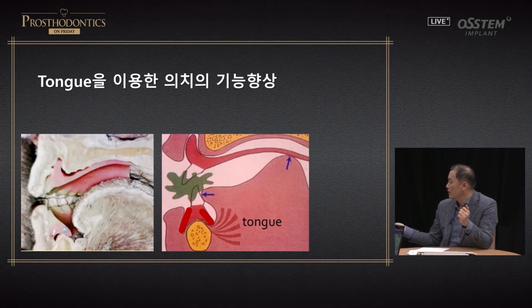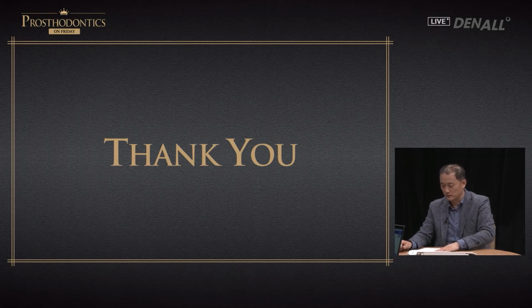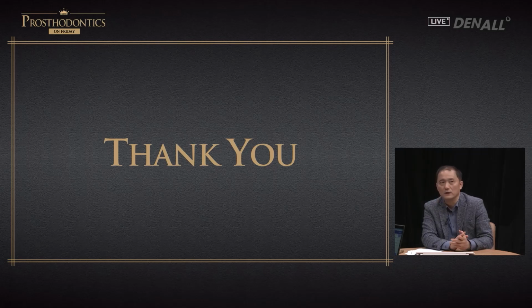But rather than doing that, if they use the tongue even in a denture, don't let it slip. There is sufficient resistance so that there will be support. And the tongue tip on the mandibular side needs to push down here to make full functional use of the denture. So you have to explain all this to the patient and let them exercise. Once they make this into a habit, it's better in terms of function and denture positioning.